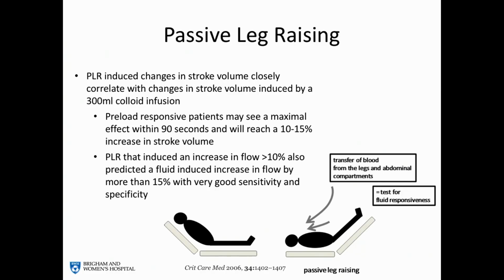If that passive leg raise induced increase in flow is more than 10%, it also predicts that fluid-induced increase in flow by more than 15% with a very good sensitivity and specificity. This is very easy to do in the ICU and very informative, and I think addresses that important question: should we give more fluid or not?